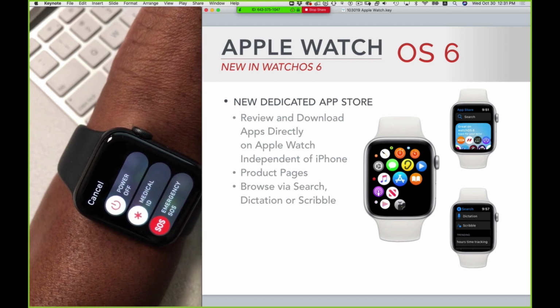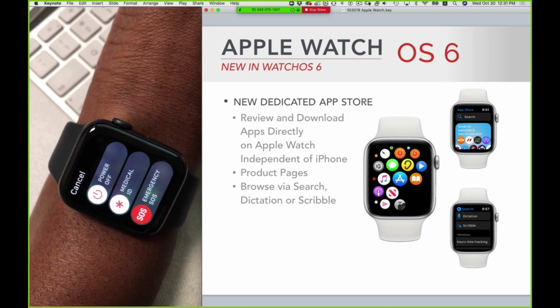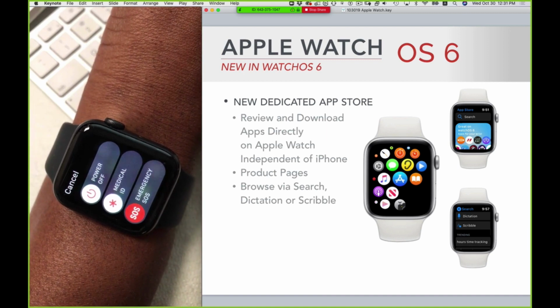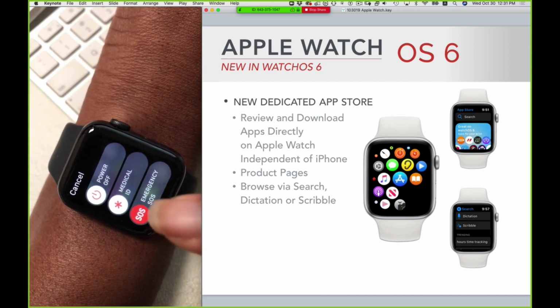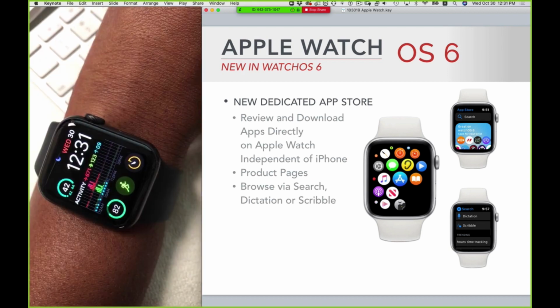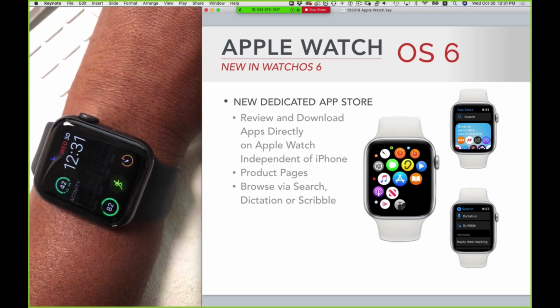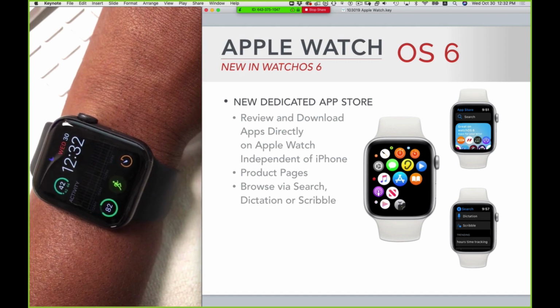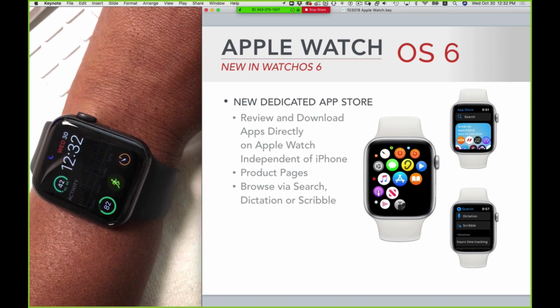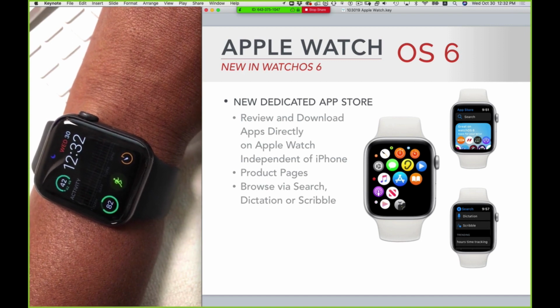With the Apple Watch, you have your medical ID button here, and that medical ID button will also show information that you've put on the iPhone. So there's definitely the ability to read whatever medical information you want people to see. I have some of that in my medical ID section. I don't know if it's sent through the emergency fall detection call, but I know that it's there.